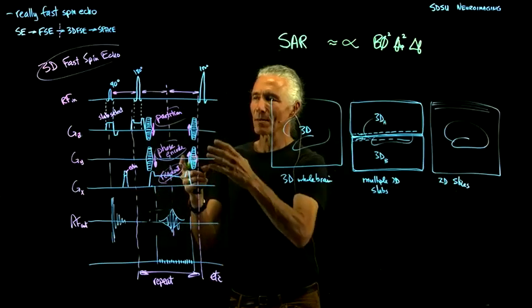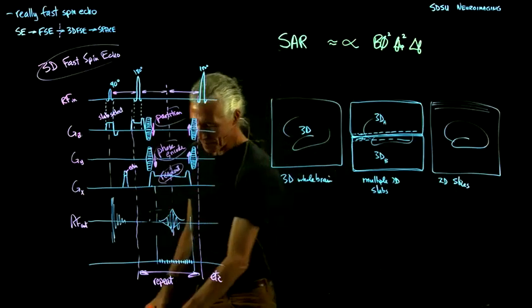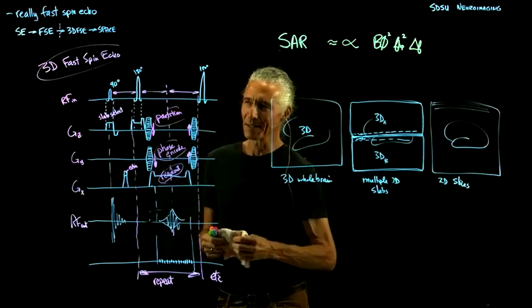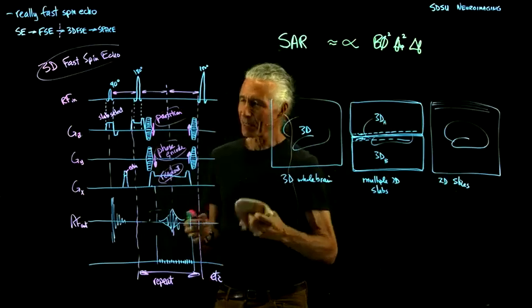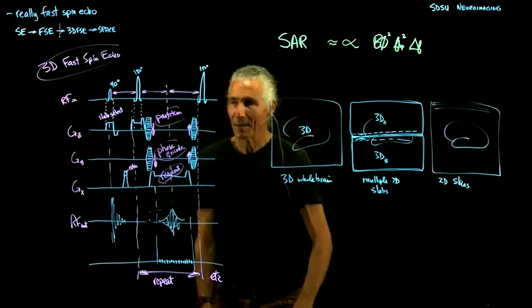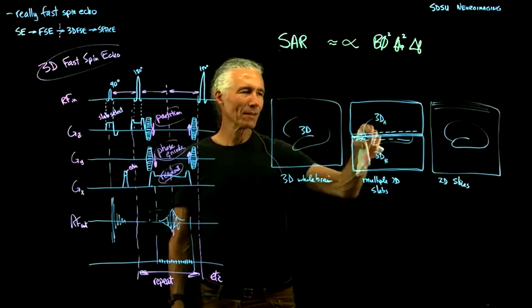In the 90s already, we had this sequence. I used it once on a preserved dolphin brain. If you go to the MRI center, you can see a reconstruction of the dolphin cortex using a sequence like this. But it never got really popular. It's just kind of for clinical use, because it's always a little fiddly.